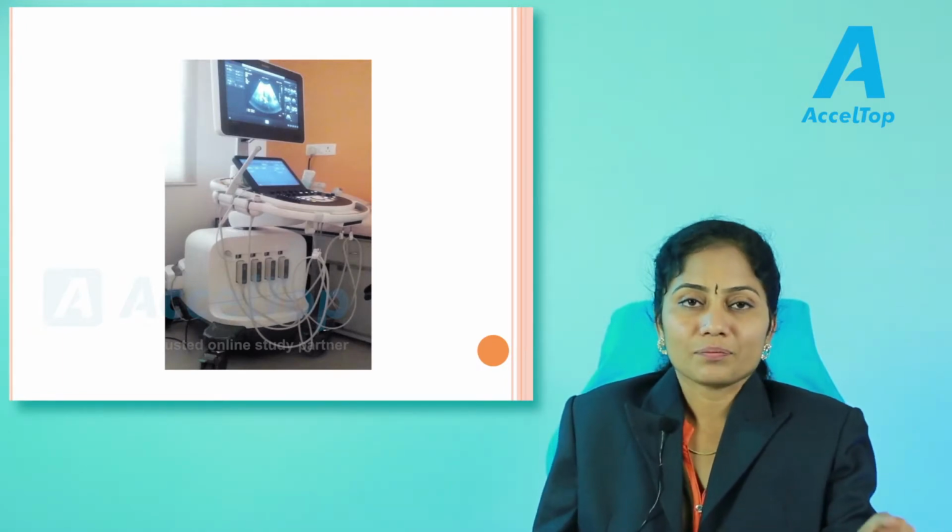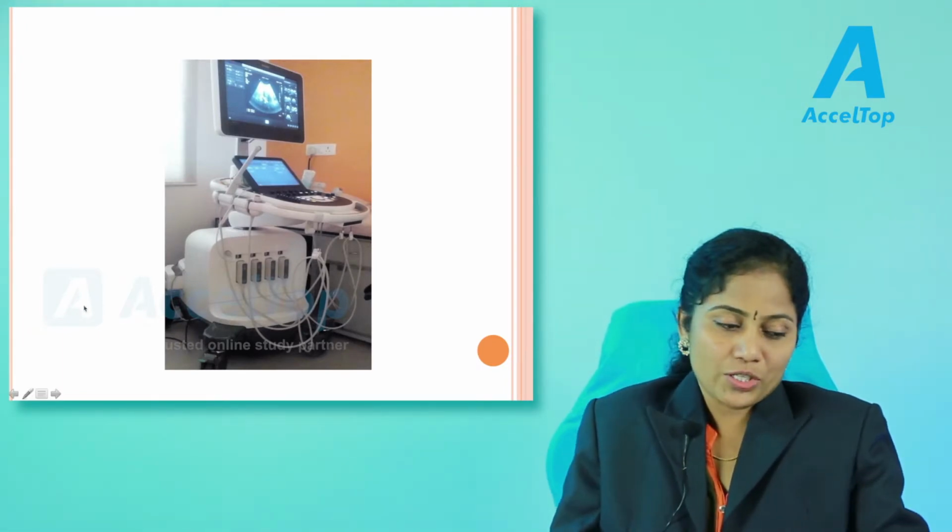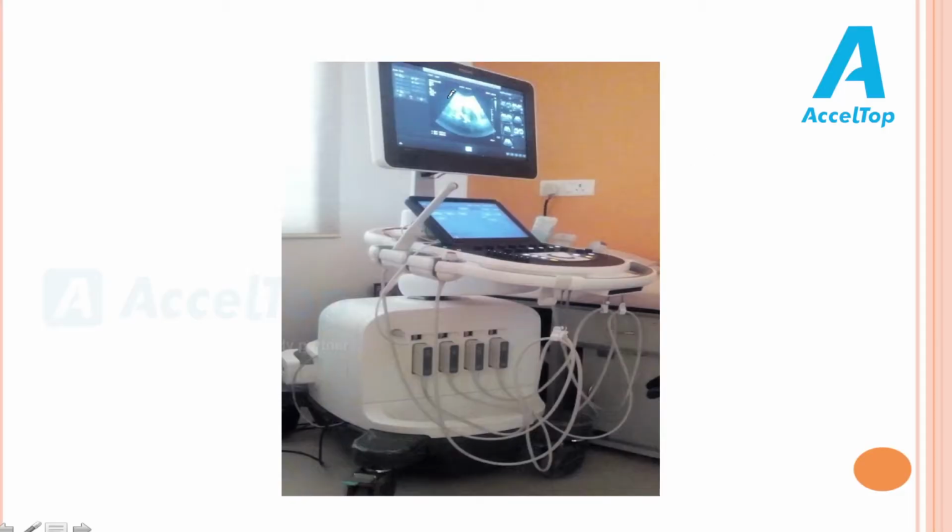So what is the machine shown in this image? This is the ultrasound machine. You can see there is a monitor here. This is the monitor.